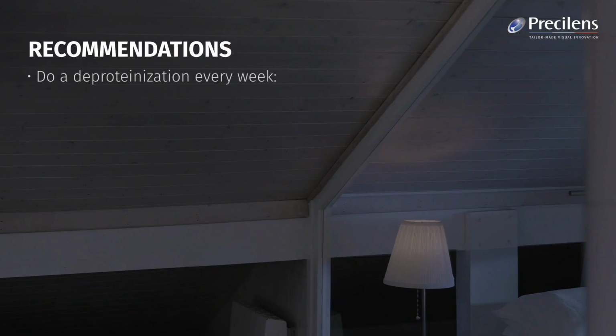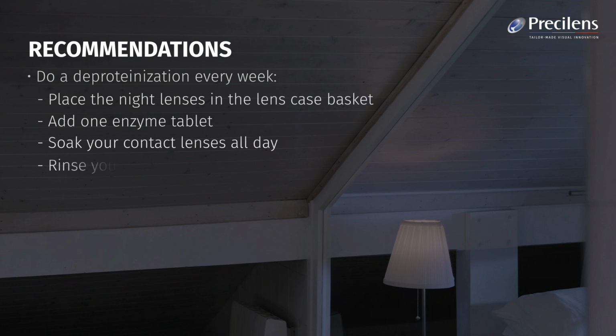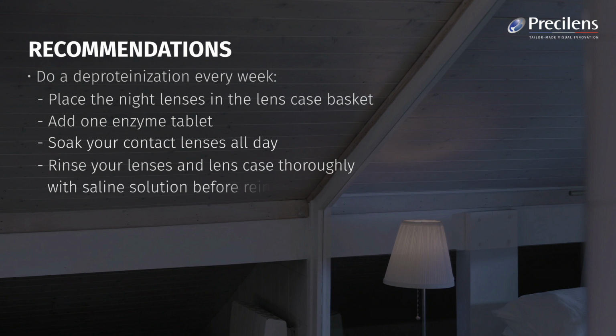Recommendations: do a deproteinization every week. Place the night lenses in the lens case basket. Add 1 enzyme tablet. Soak your contact lenses all day. Rinse your lenses and lens case thoroughly with saline solution before reinserting them.